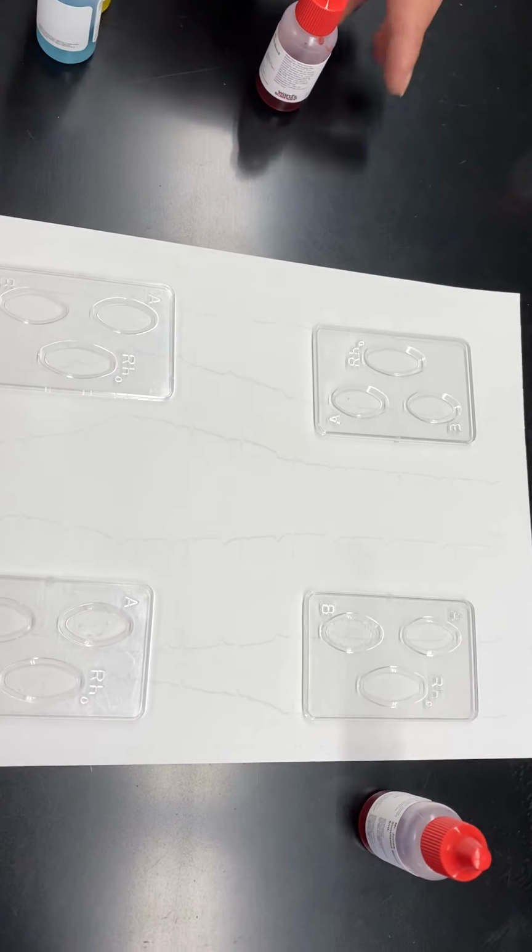And the last one is for RH, again simulated anti-RH serum, which means this is anti-RH antibody. Again, these are not what we can find normally in the human body, but these are what we can use to identify an individual's blood type if we have no idea what it is.